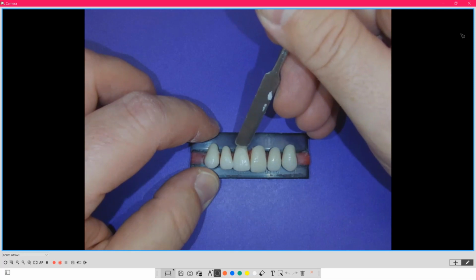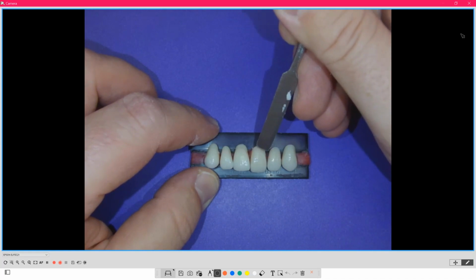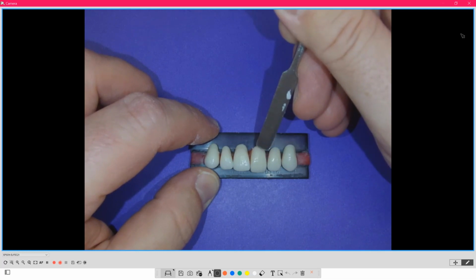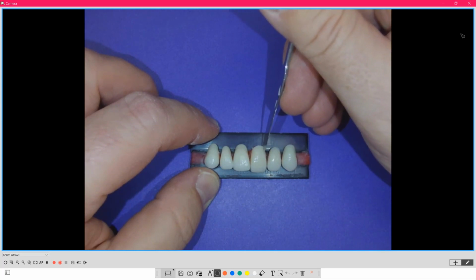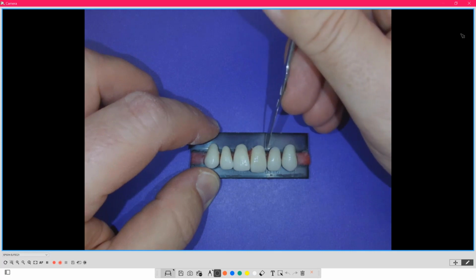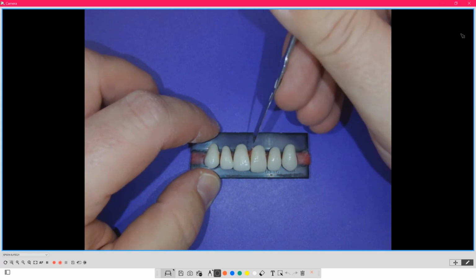That was just an idea for dental technicians back then to have something to wax to, where now we don't put a collar on, so you can wax anywhere that's necessary to allow more adaptation to the patient and the patient's needs. For smile lines and things like that, it's far more effective, and it gives us less interdental papilla, which is really important, because the patient always, in a wax try-in, smiles really wide and says, oh, I can see wax. So the wider neck surface and no collar allows us to hide the interdental papilla even more than we could before. So again, it's not 1950s anymore, everybody. It's time to move forward.